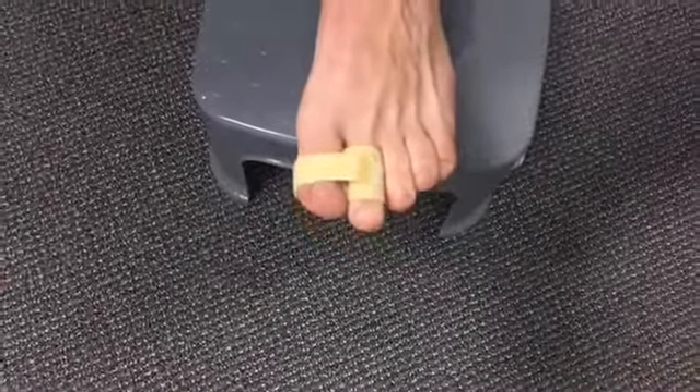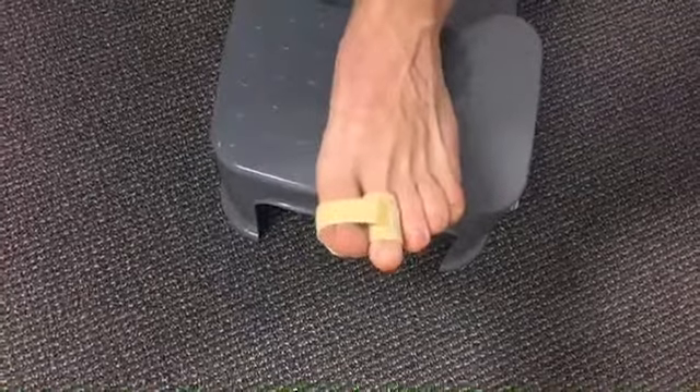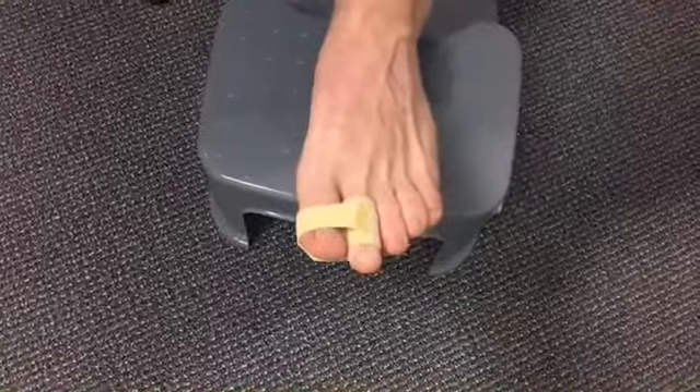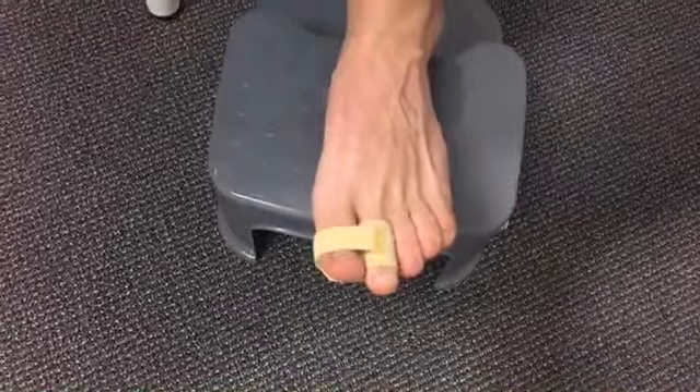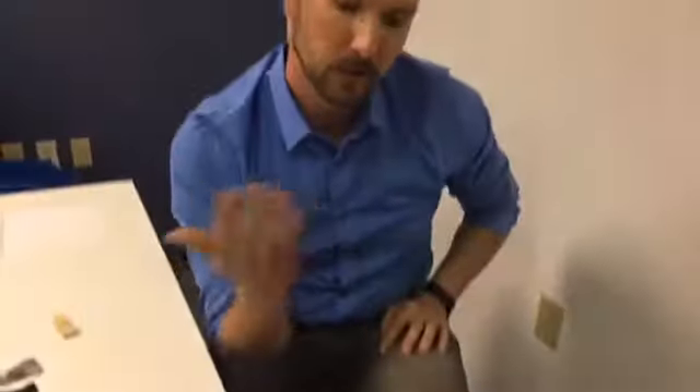As you could see when putting it on, it might have been a little tough to slide on — that's because it's got grip material, so it's not going to slide or slip on you when you're wearing it. These are very thin and lightweight, so you can wear them in your shoes and under socks, and you're not even going to notice they're there.